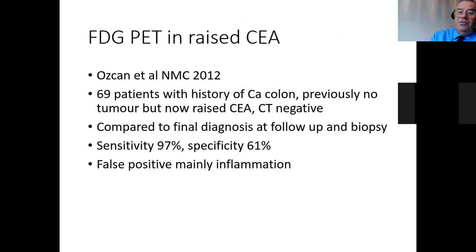So there have been some reviews. This was a review from a Turkish hospital looking at patients who have just elevated CEA and a negative CT. They confirmed the uptake compared to biopsy, and they found the sensitivity was high, nearly 100%, but the specificity was low because there were post-operative inflammatory conditions which could last for months or years.